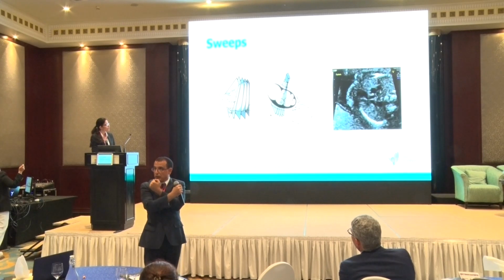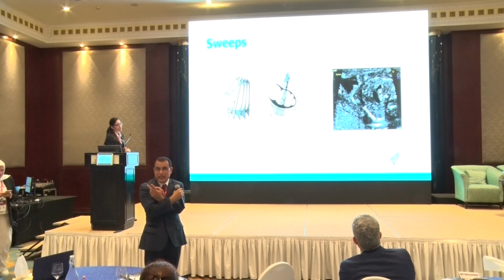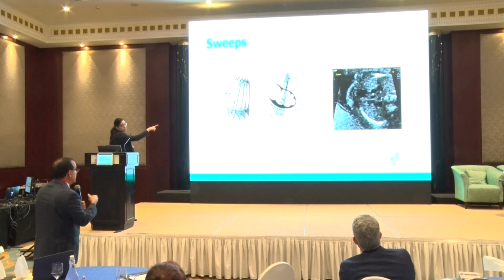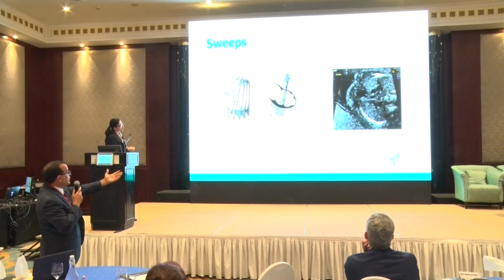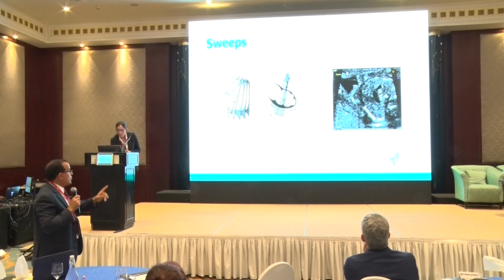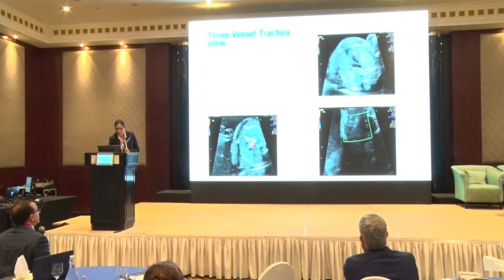If I don't see the aorta first and I see an artery that is kind of branching, that is transposition until proven otherwise, of some form. And this is what's going on with this patient, the one that you were talking about. This is a normal sweep, just for you. It's excellent. So you see the aorta when you sweep, and you see the pulmonary. The pulmonary gets right under the sternum, right away. It's not far at all. So this is the normal sweep, but if you go back to the one that you showed us, you will see the pulmonary. Look at it. It's very beautiful. You showed it very nicely.